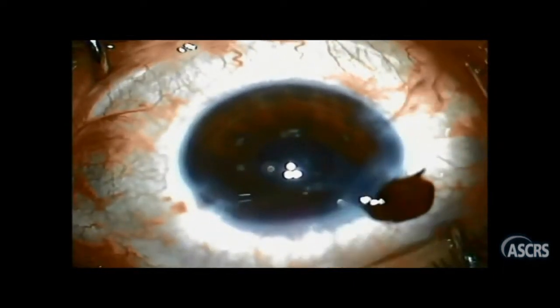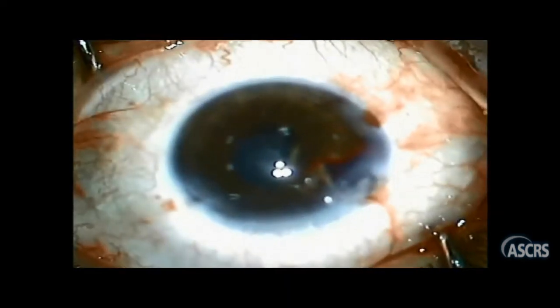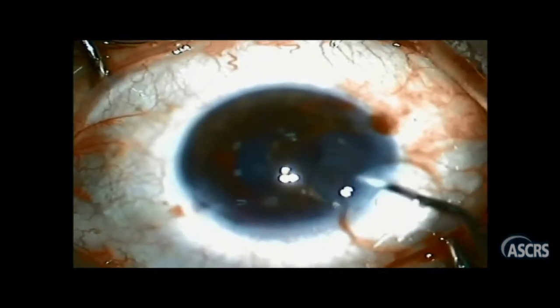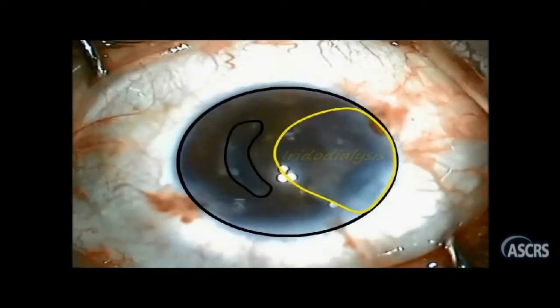She only saw the bleeding, and thanks to our lord she finally decided to come out. She injected viscoelastic and that's when — a huge iridodialysis is showing here, nearly extending all through the vertical 180 degrees.